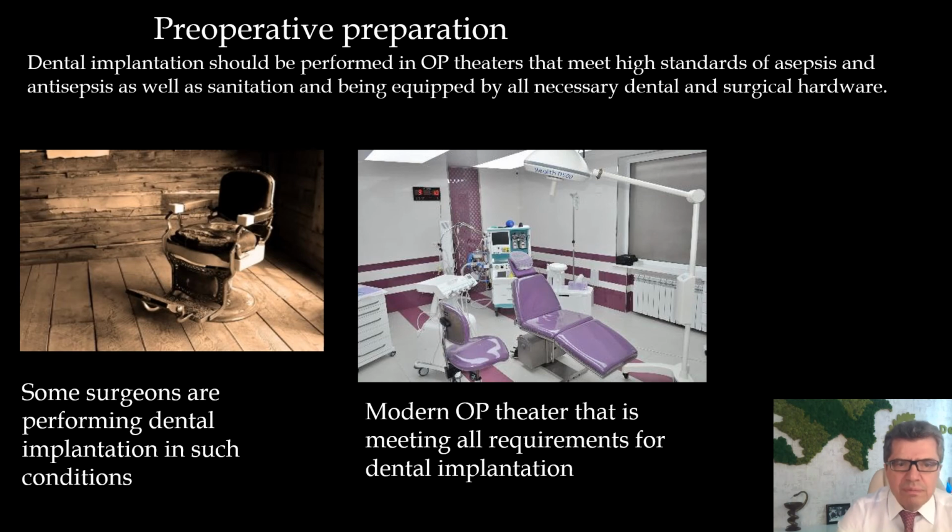But first of all, preoperative preparation is necessary. Some surgeons are performing dental implantation in such conditions. Here is a modern operation theater room that meets all requirements for dental implantation. Dental implantation should be performed in an operation theater room that meets high standards of asepsis and antisepsis as well as sanitation, and is equipped with all the necessary dental and surgical hardware.